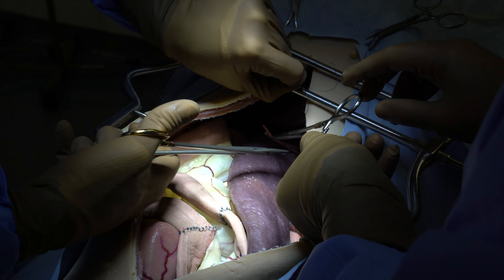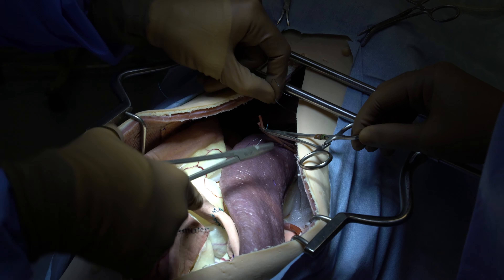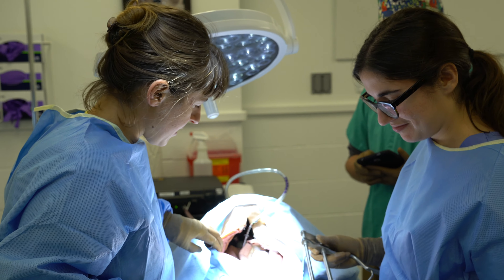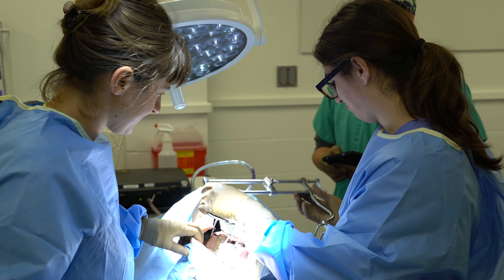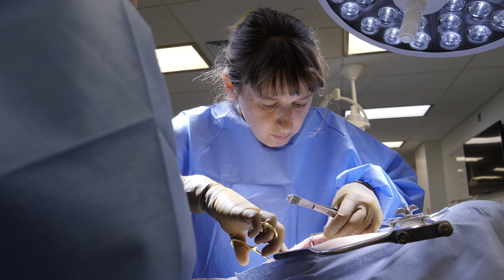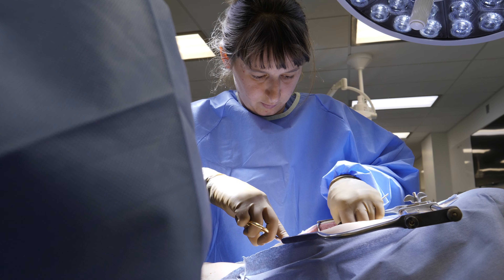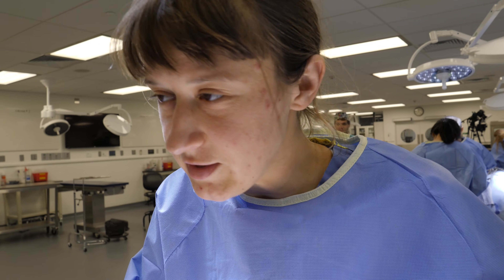I got it. Bleeding is under control, and the heart rate is coming back down slowly. Once you're done, cut that and release the hemostat and see if it's bleeding. Not bleeding. We saved him.